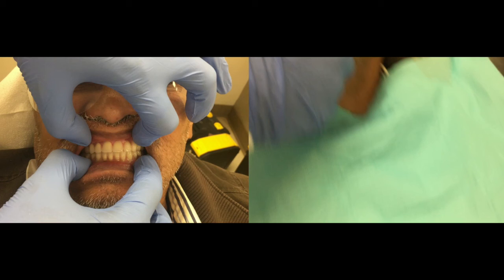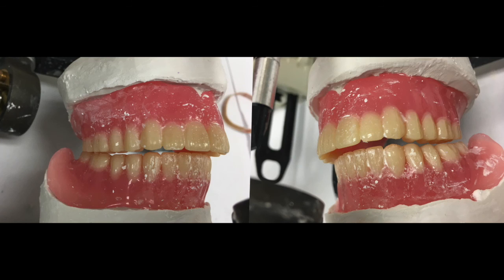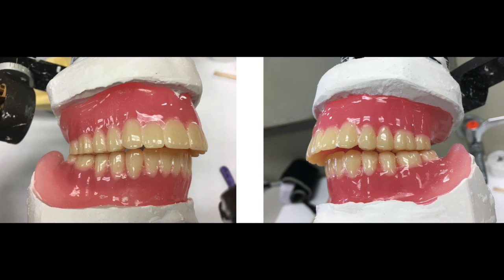So I believe that you were able to see the gap on one side clearly in the second video. And this is actually what happened intraorally. Only one tooth is holding it up and no other teeth are in simultaneous contact. And this is after we adjusted the occlusion to achieve bilateral contact.